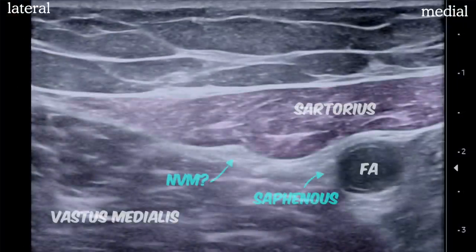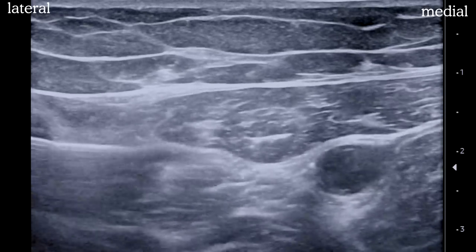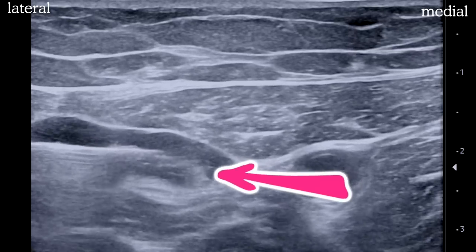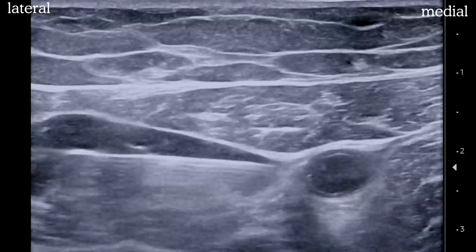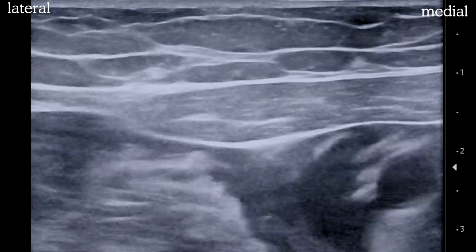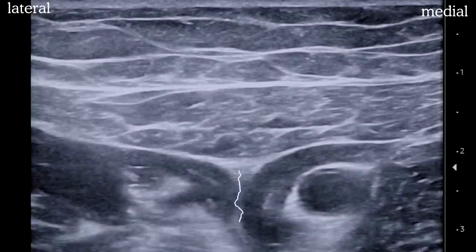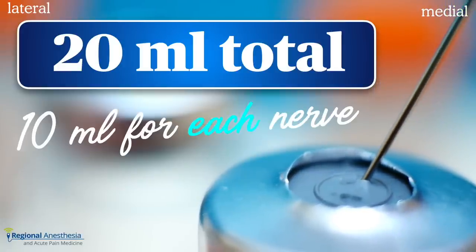Let's do this. Here we see our two muscles and the artery. The saphenous nerve will be next to the artery and the NVM somewhere in this intermuscular plane. Our needle comes from the lateral side aiming for the intermuscular plane. We initially get a local muscle twitch of sartorius, but then as we advance, we evoke a true twitch of vastus medialis by stimulating the NVM. As we inject, we see the NVM getting pushed down — we'll put 10 mils here. Then we'll continue advancing, being careful to avoid NVM, feel some resistance at the vastoadductor membrane, and then pop through. Injecting 10 mils in this space blocks the saphenous nerve. We use 20 mils of local anesthetic total: 10 mils for the nerve to vastus medialis and 10 mils for the saphenous.